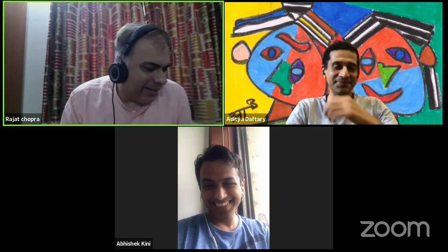Excellent talk, Aditya. I learned a lot from your talk. I just wanted to know what is your protocol for tarsal coalitions, because I, in my practice, do see a lot of patients in their teens coming to me with pain and repeated ankle sprains. So, but finding out whether it is a bony or whether it is a cartilaginous or a ligamentous coalition. So, how do you go about it?